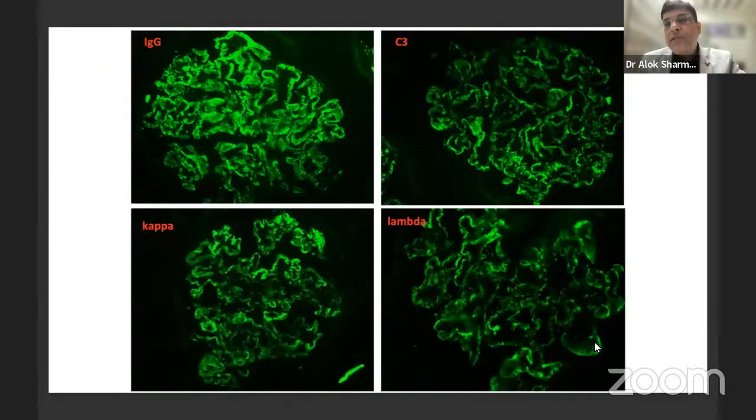So these are a few images of typical pattern of IgG staining in direct immunofluorescence. And all these appear green because the fluorescent compound which we use is FITC, which is fluorescein isothiocyanate, and it fluoresces bright green when you incident a blue light on it. And you can nicely see the fine granular staining along the GBMs, which is characteristic for a membranous GN.